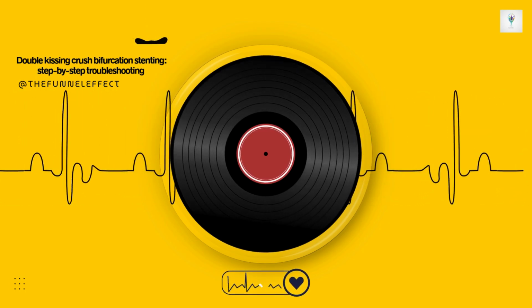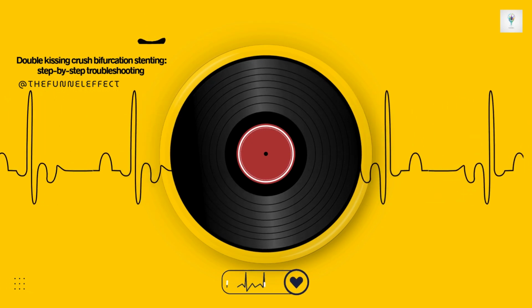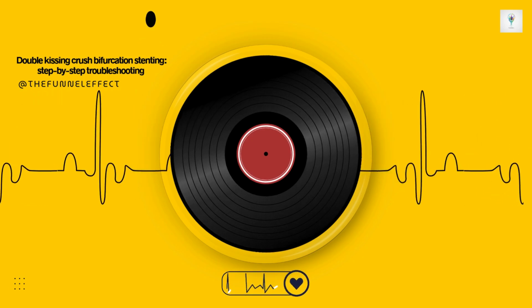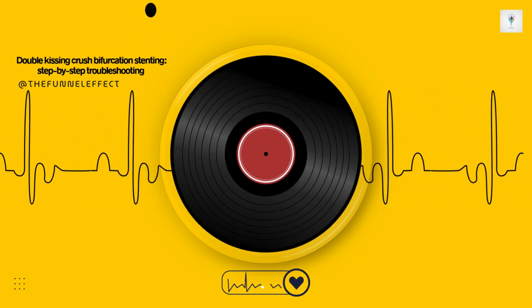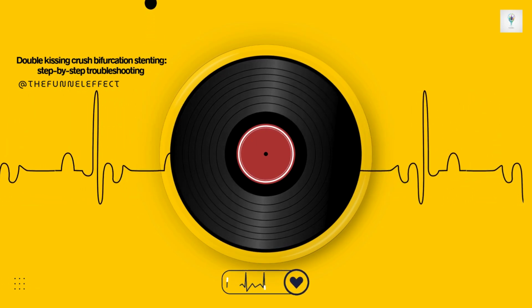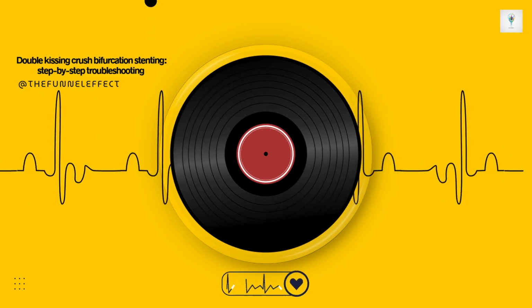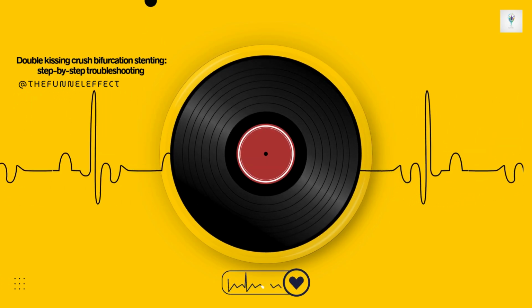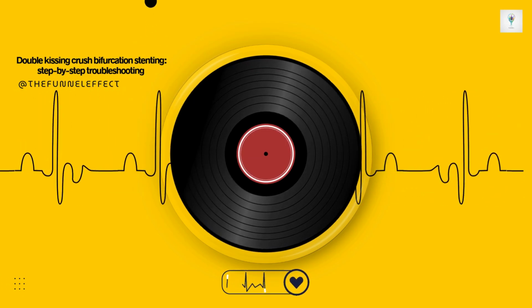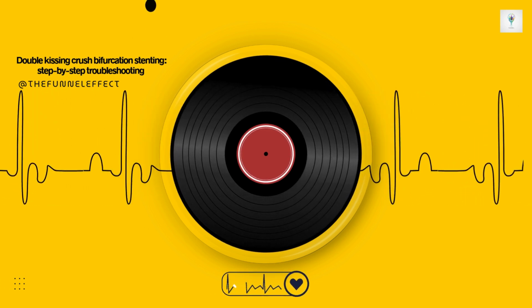Makes sense. And then lesion preparation. Pre-dilating with balloons. This isn't optional, is it? Definitely not optional. Mandatory. If you don't prepare the lesion properly with balloon angioplasty first, you'll likely struggle to deliver the stents later. It wastes time, increases radiation, increases risk. If there's heavy calcium, simple ballooning might not be enough. You might need to consider plaque modification up front, like rotational or orbital atherectomy, basically drilling or sanding the calcium to make sure subsequent devices can pass and, importantly, fully expand.